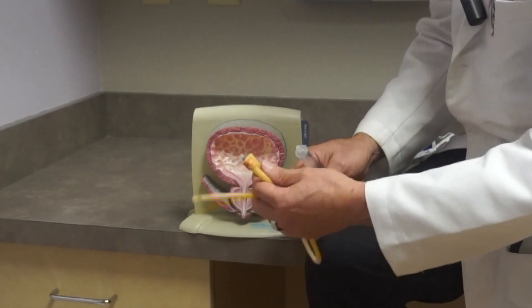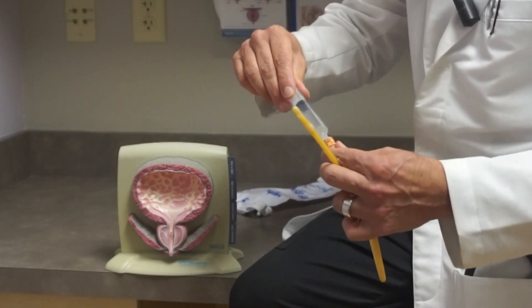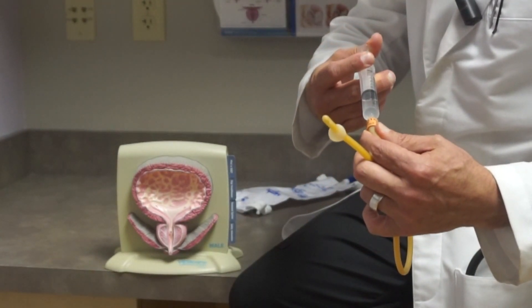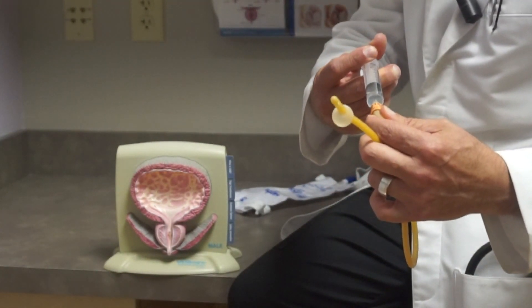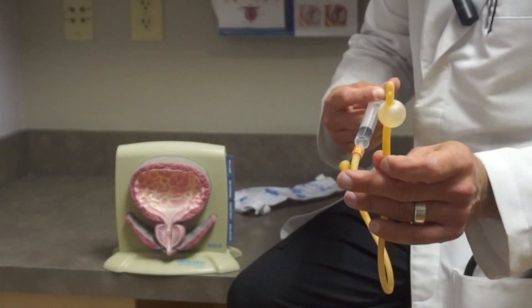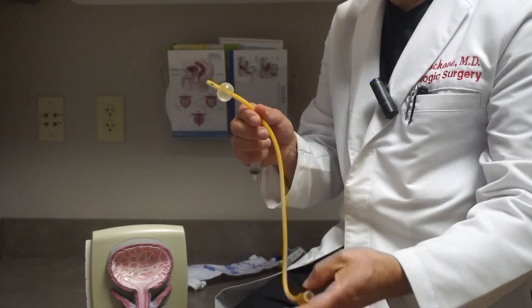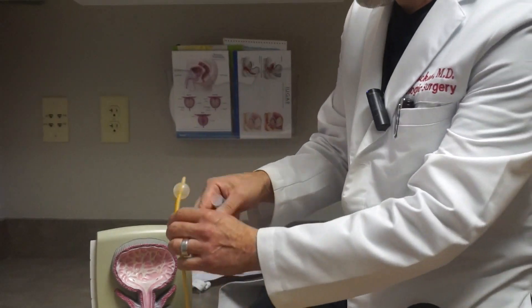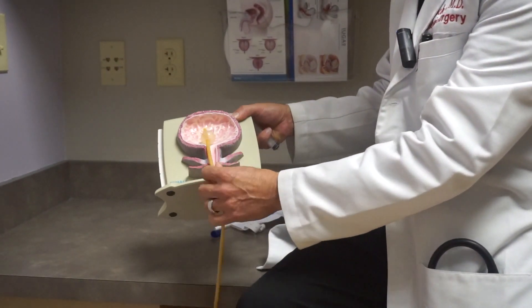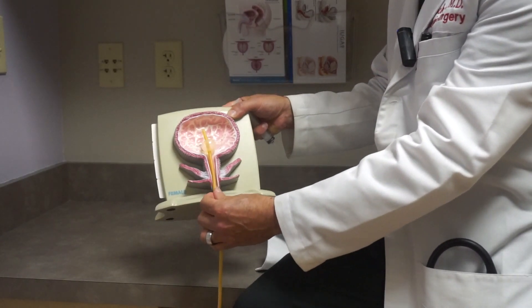How does it stay there? Well, at the end of the tube that goes into the bladder, there's a little balloon. So if I put fluid through a filling port in the catheter, it fills up the balloon, and it's able to stay there through a locking mechanism. If the catheter is in the bladder, that balloon prevents the catheter from getting dislodged.